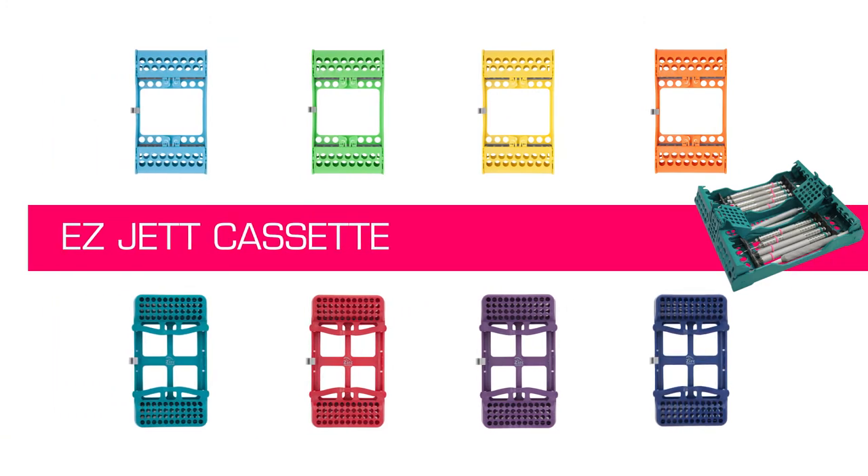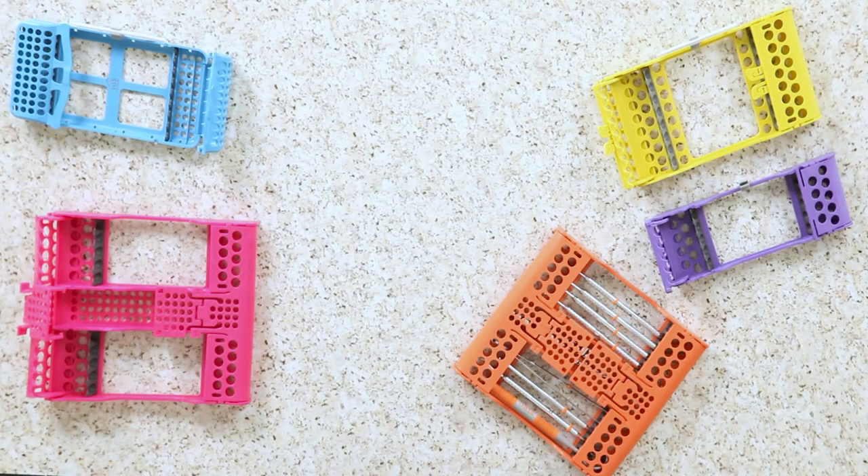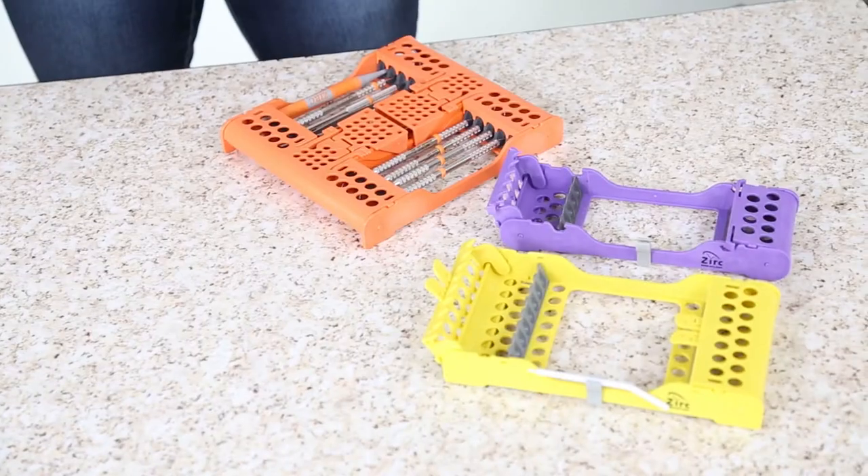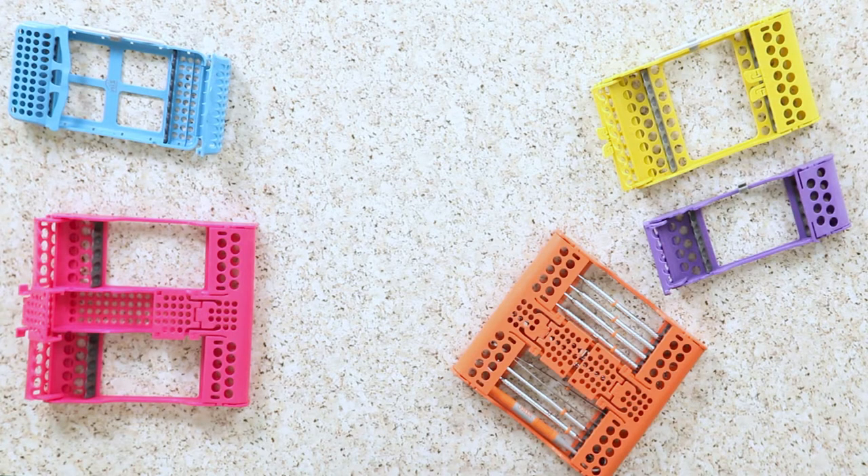Hello. Today I'm going to introduce you to Zerk's family of EasyJet cassettes. The cassettes are used to house your instruments from the procedure table through the sterilization process. They come in four different sizes.